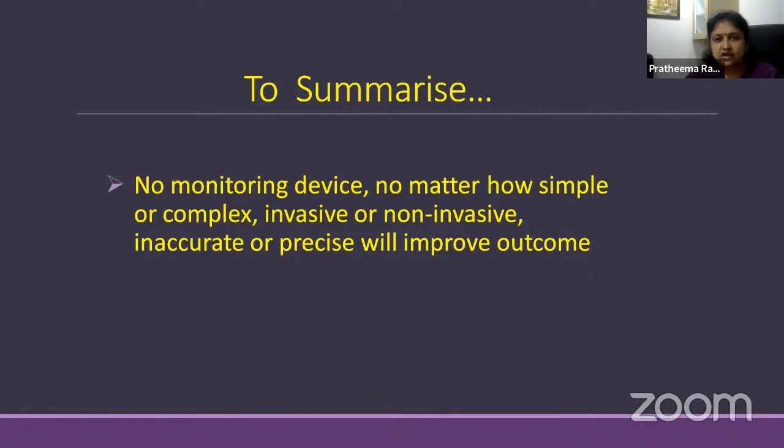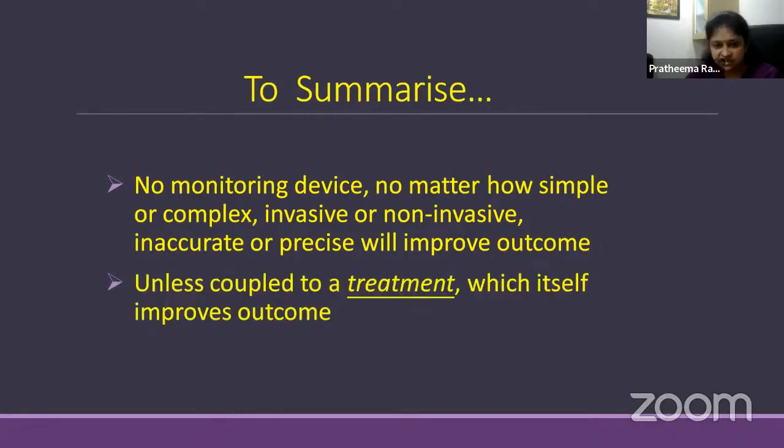So whatever it is, it cannot be improving the outcome. It is the judgment and the treatment, and the doctor or the medical treating team makes the difference in improving the outcome, because it should be judiciously used. Just because it is available, we cannot put an esophageal Doppler monitor on all the patients and take whatever numbers are there as foolproof.